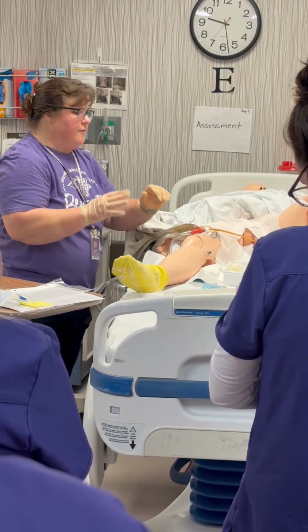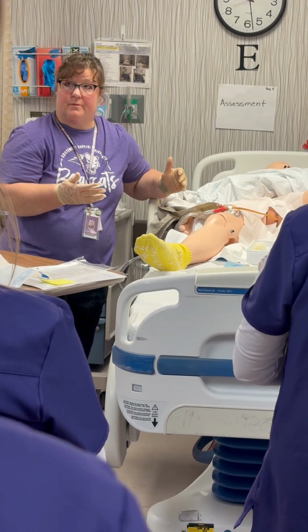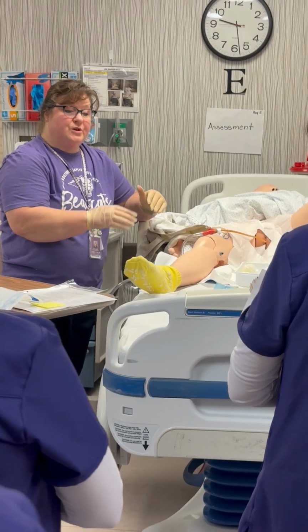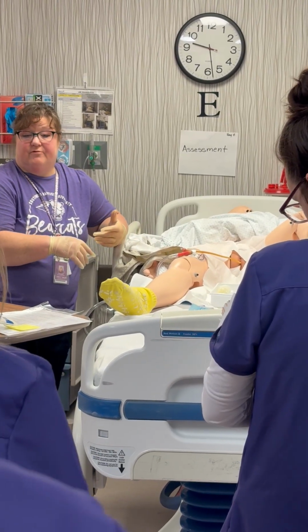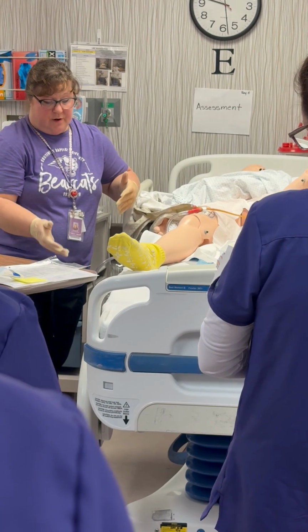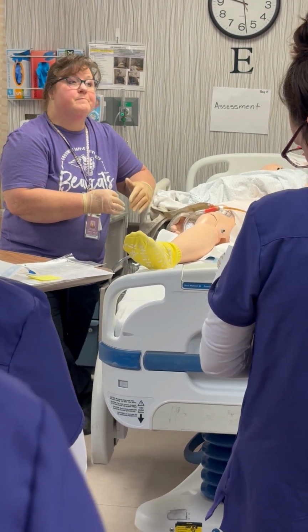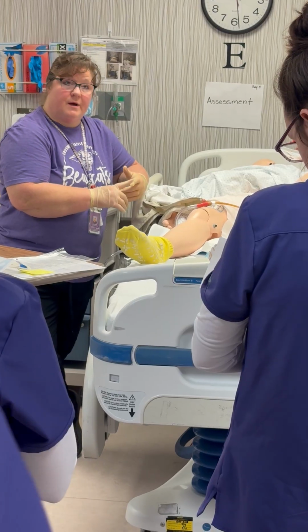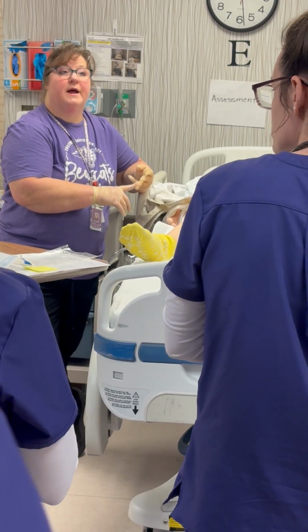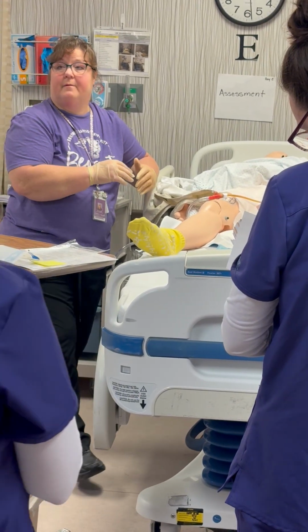When you do your checkoff, you're gonna leave everything in place because now you have to take it out, okay? So just leave it there, and make sure you say, okay, I'm gonna document it's a 16-French Foley catheter, patient tolerated it well. I got immediate return of clear yellow urine. You're gonna document that COCA, okay? All right, COCA is color, odor, clarity, and amount. Consistency or clarity, yeah, okay?